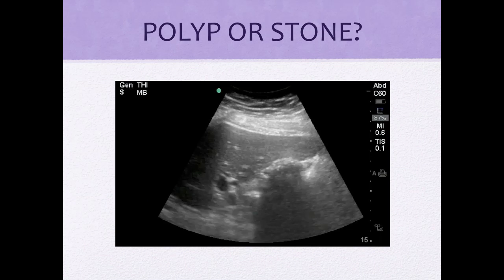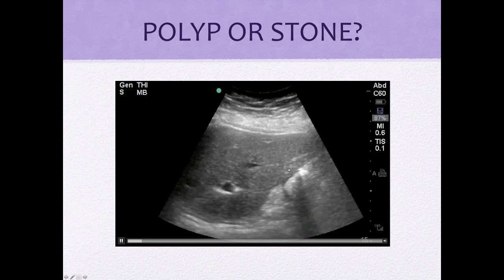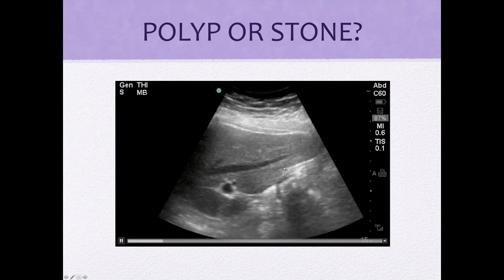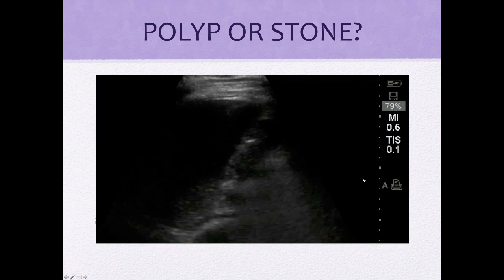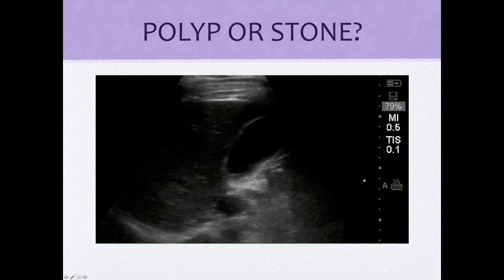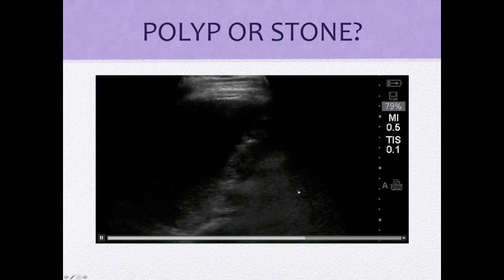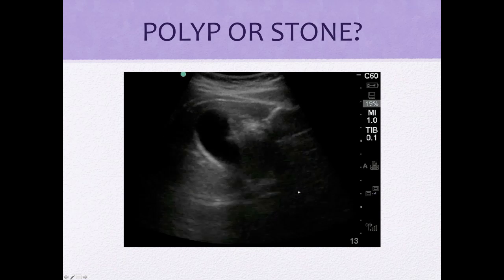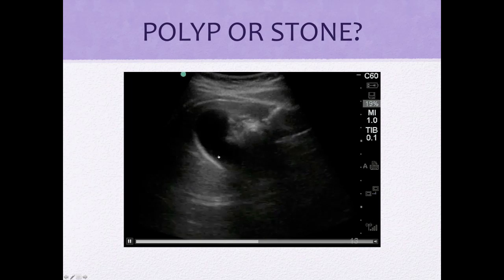So what do you think — polyp or stone? Stone, right? See, here's your gallbladder filled to the brim with stone — look at that shadowing it creates. How about this one? Gallbladder polyps — echogenic foci, and you really don't see any acoustic shadowing. And this? That's right, gallbladder polyp — that echogenic area right there, no acoustic shadowing.